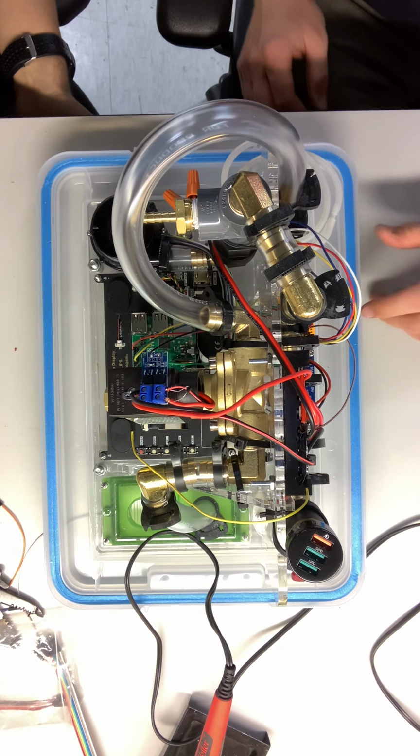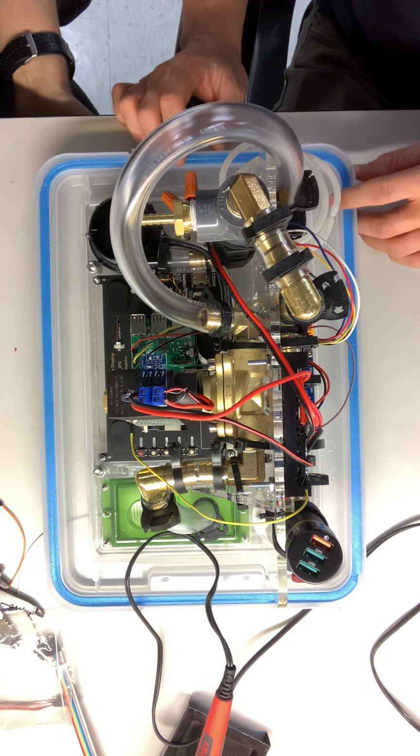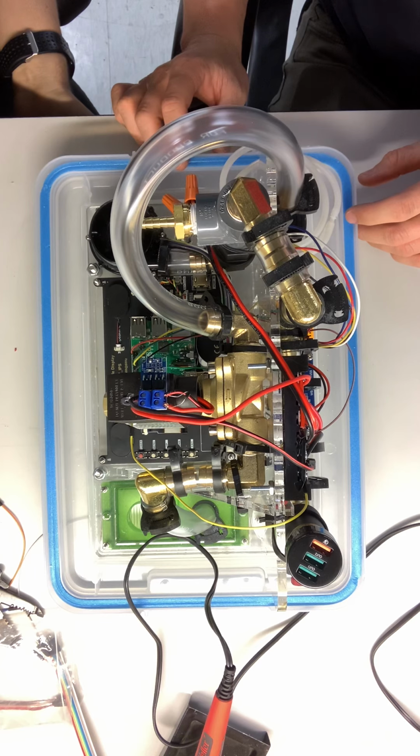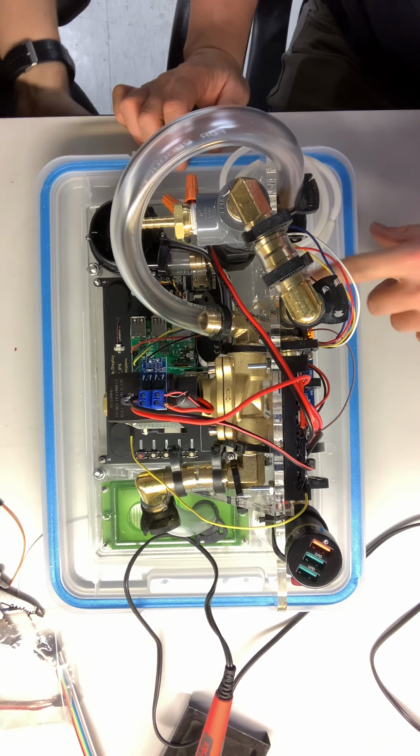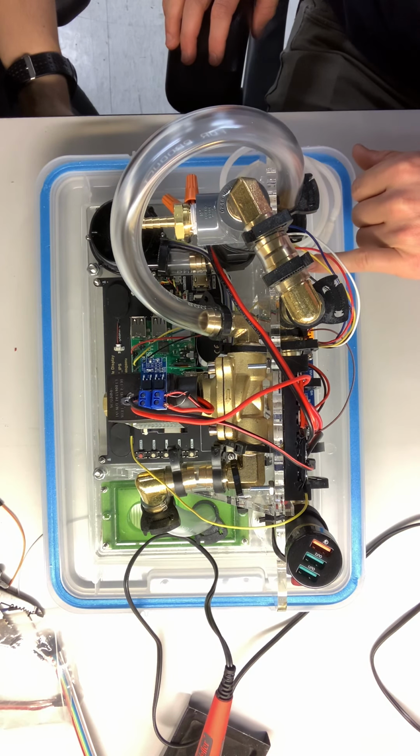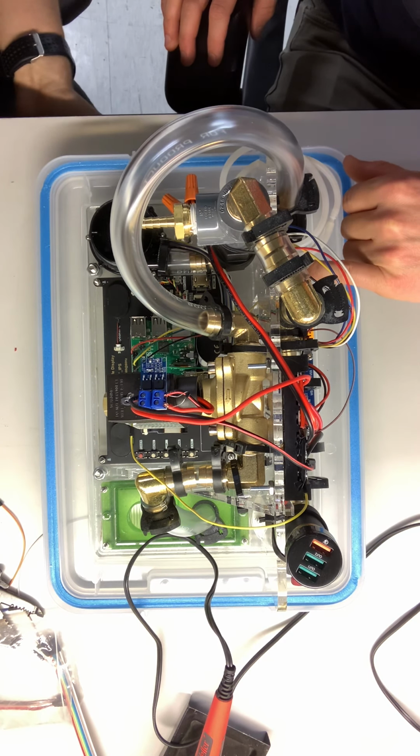Okay, walking through the alpha wiring diagram. So we have our 3 pressure sensors here. I put the patient pressure in the middle.